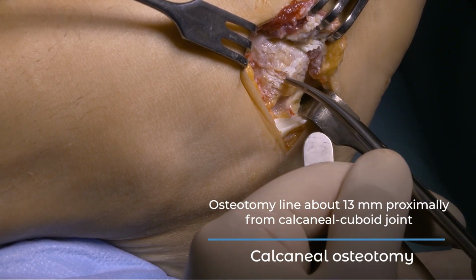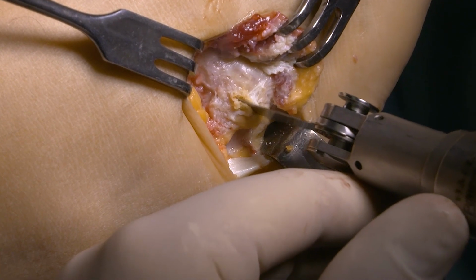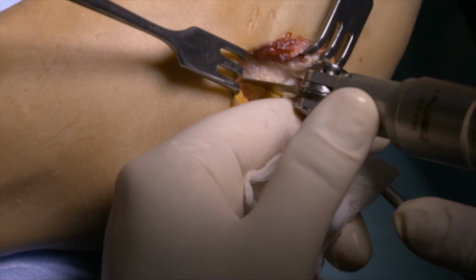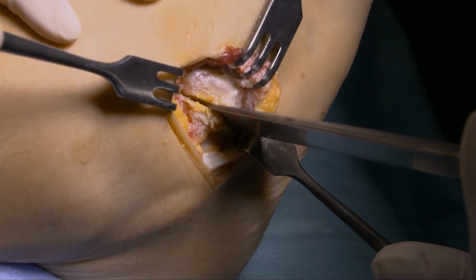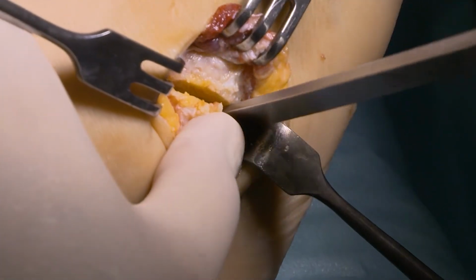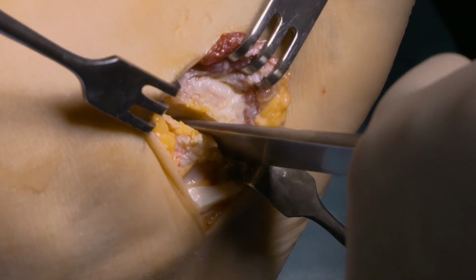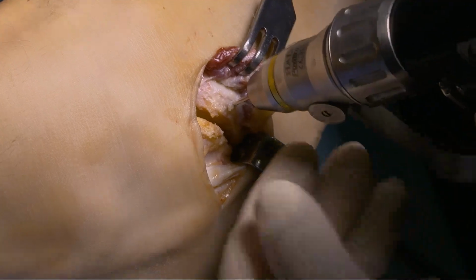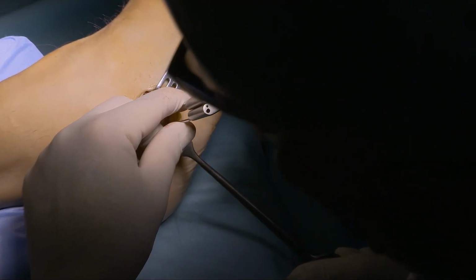The location of the osteotomy is about 1.3 cm proximal to the calcaneocuboid joint. The osteotomy is started with the help of a saw, so as not to lead to a fracture of the calcaneus, and then continued with a chisel. It is a good idea to use the Hintermann device to open the osteotomy site from the lateral side.